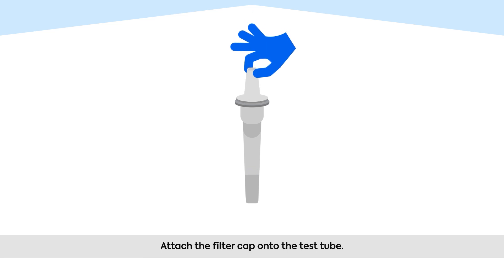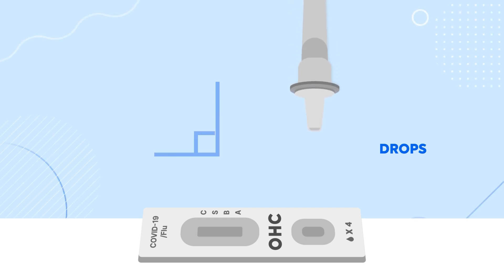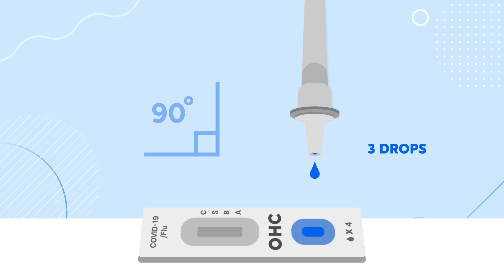Attach the filter cap onto the test tube by pressing the wide end into the tube. Carefully squeeze only four drops of the buffer solution into the sample well at a 90 degree angle. Please be cautious not to exceed four drops when squeezing the tube into the sample well. Hold the capped tube vertical and upside down so the tip of the cap is just above the sample well, and allow four drops to fall into the well.